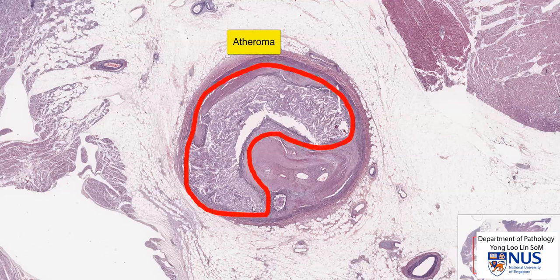The atheroma is occupying probably around 75 to 80 percent of the internal diameter of the artery, causing some narrowing. Superimposed on that, there has been formation of a thrombus, and here we have an organizing thrombus.